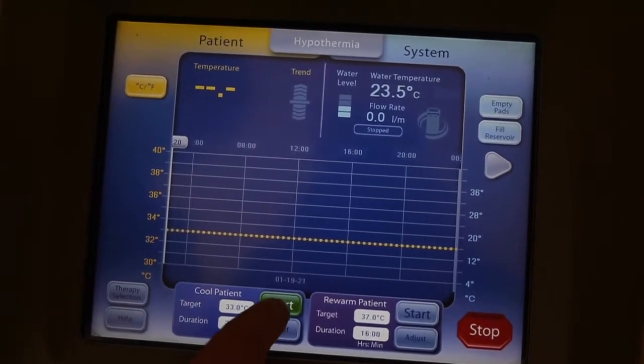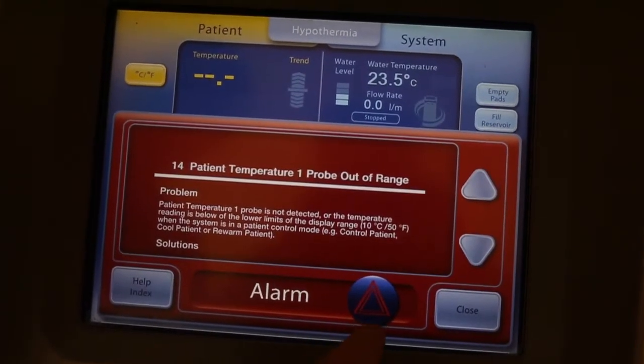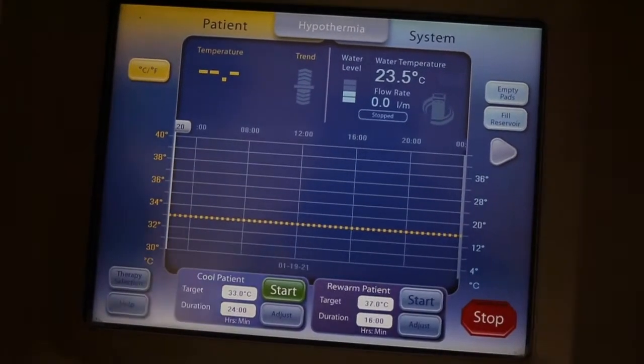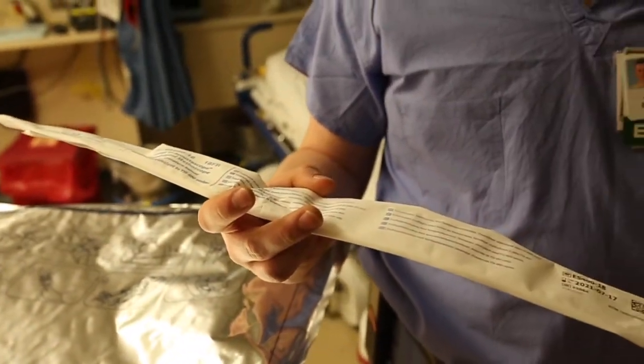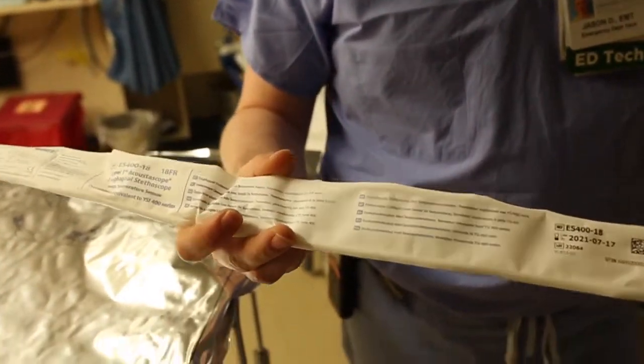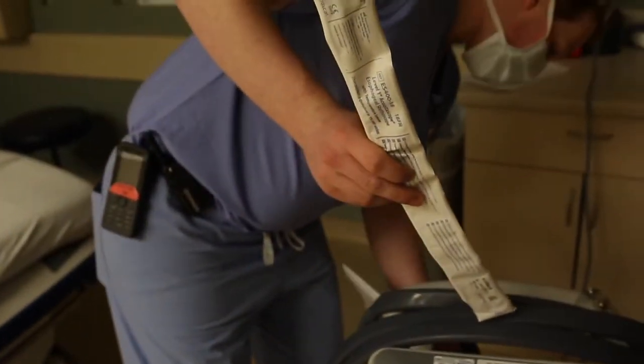To cool the patient, press start. It'll give an alarm because there's no temperature probe. When you get the pads, there's also a box of temperature probes - give this to the nurse and they'll set it up. On the back here there's a wire, and this connector plugs into that adapter for your temperature probe.